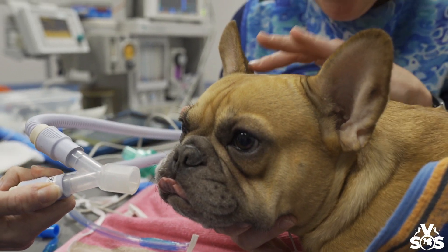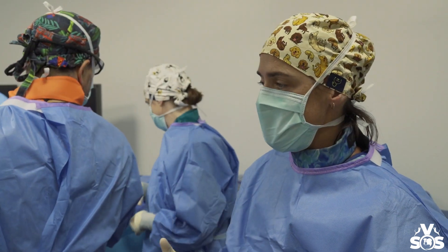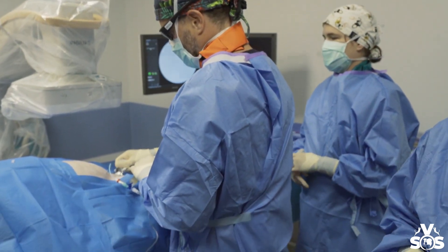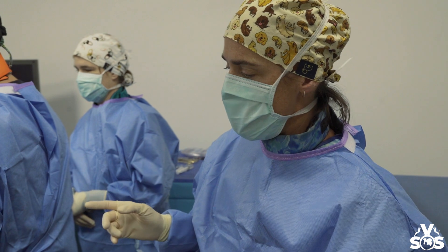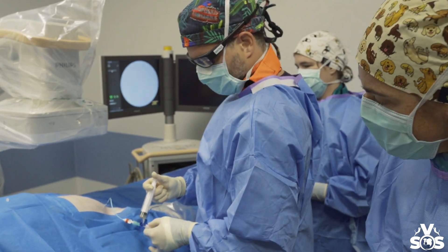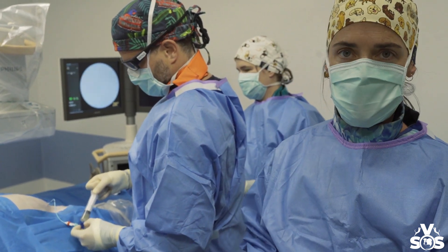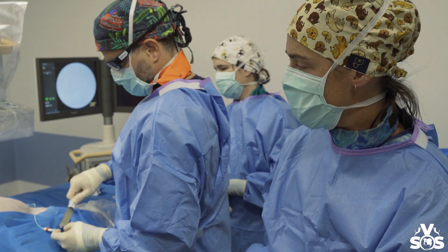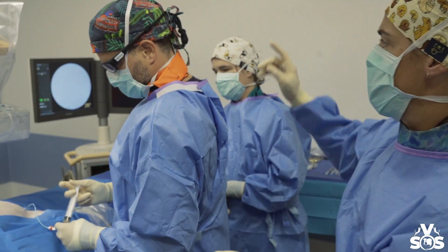We've got little Scout here today. She's a three-and-a-half-year-old French Bulldog with a really rare big tumor in her abdomen called a biliary cyst adenocarcinoma. Today we're doing a procedure called TACE — trans-arterial chemo-embolization, or maybe just embolization. Dr. Benz is removing all this fluid from her belly; it's swollen with a bile-type, mucus-like consistency, making her feel really uncomfortable like a big pregnant lady. Once we relieve the pressure, we'll access her femoral artery in the groin and all the work will be done through the arteries under fluoroscopy on the screen.